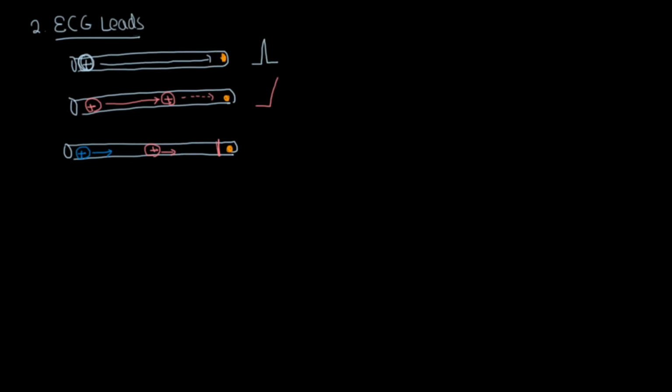So what that would look like if you were to separate the two, it's going to look like this, and at the same time, it's going to look like that. But in aggregate, what this sensor is going to show is going to be something along the lines of that.